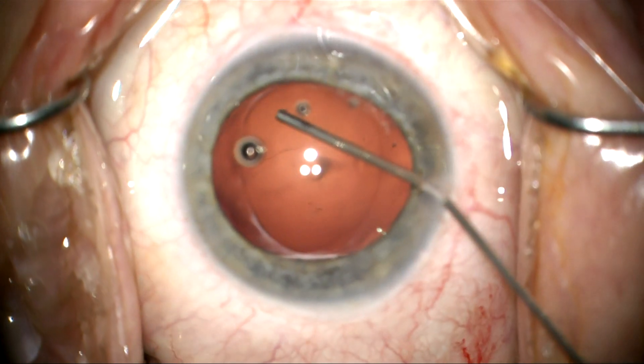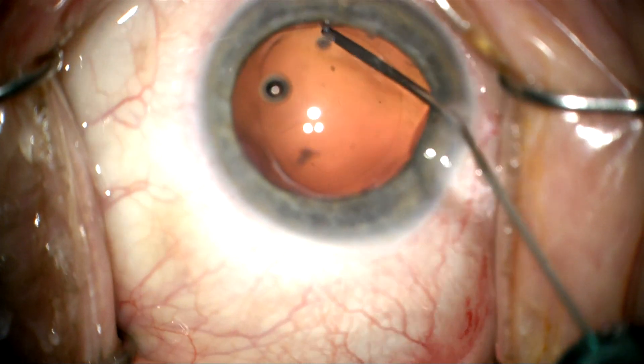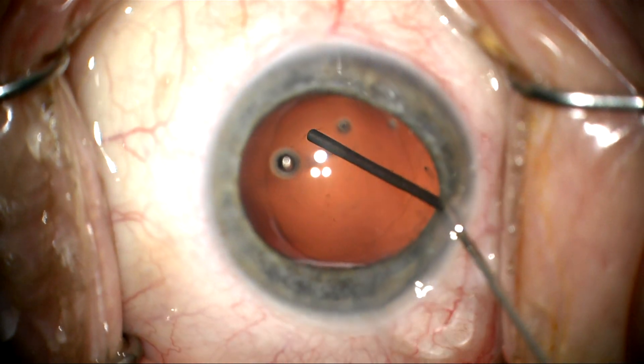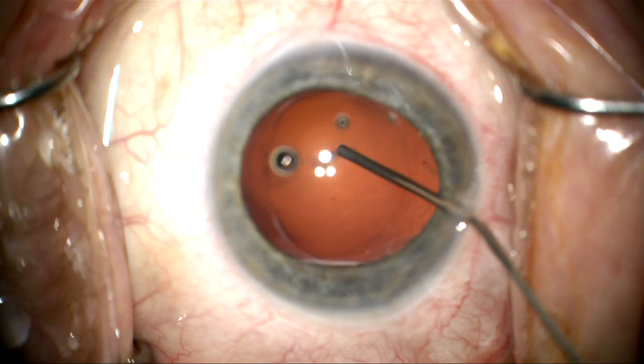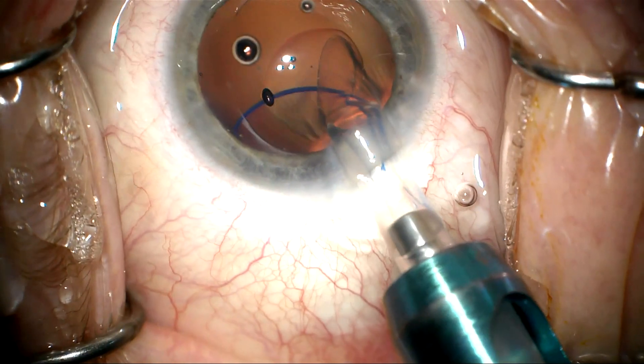Now I'm going to go ahead and inflate the capsular bag. The posterior capsule looks a bit floppy here. I'm trying to distend it with viscoelastic, but it looks redundant and floppy. Still, it looks intact — I can tap on it and feel it.